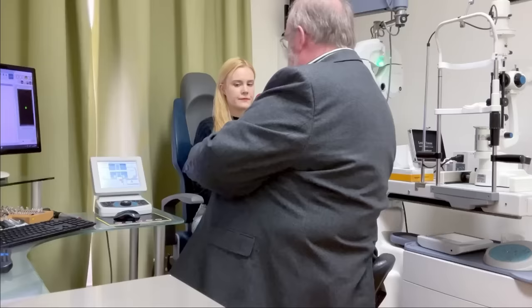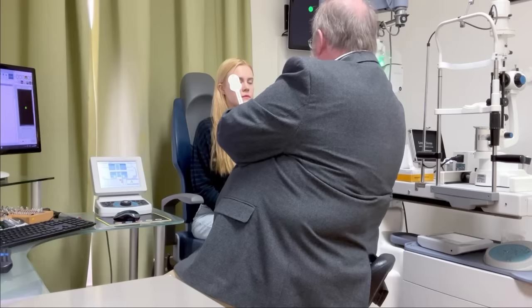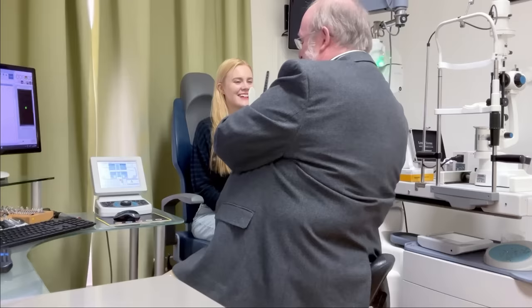Now, can you see my little white dot here? Yep. Keep looking at that for me again. And again, is that just moving slightly, or is it staying still? I think it's moving side to side. It's a little bit side to side, okay. So keep looking at the dot for me.